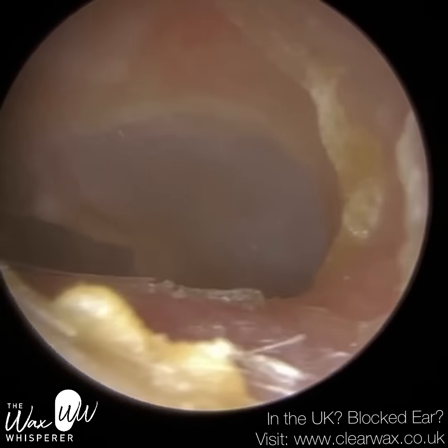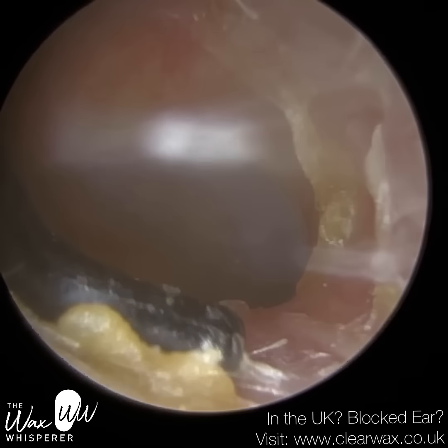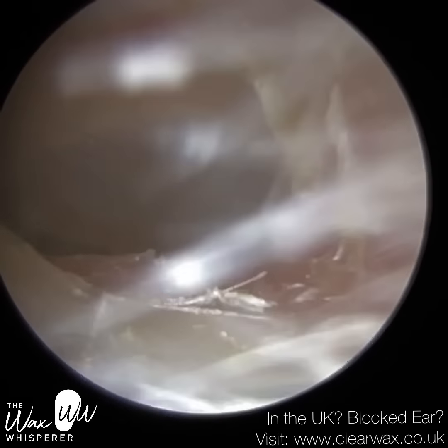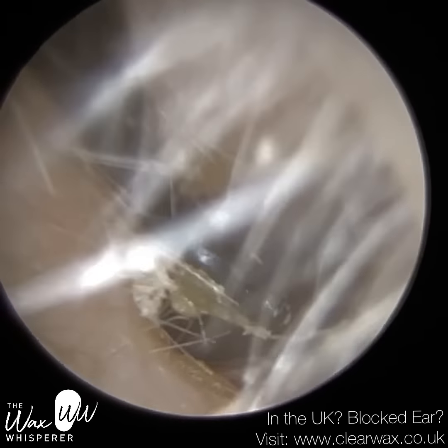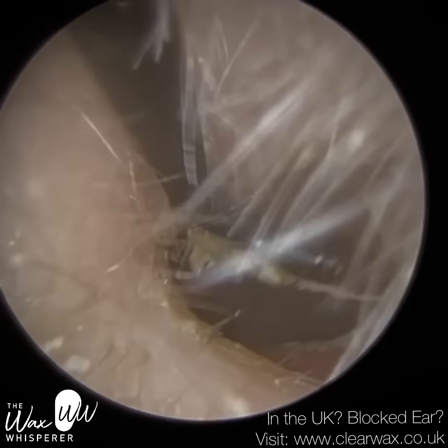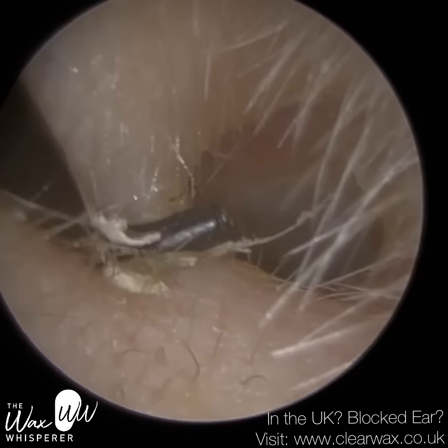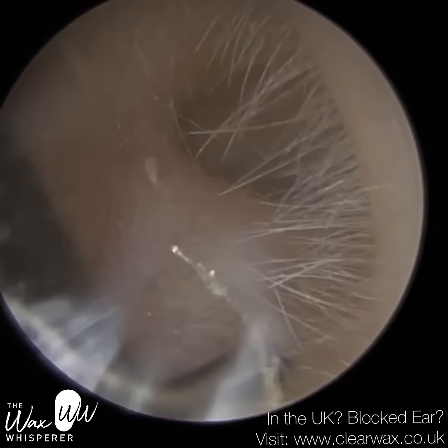And you would need to soften the wax or the keratin using some ceruminolytics, so earwax drops, and that will help soften the wax and the keratin to get a suction grip. However, there's no need to use the suction on this occasion because we could just simply remove it using the hook. There was a nice opening at the roof of the ear canal, which I glided the St. Bart's ear hook in horizontally.